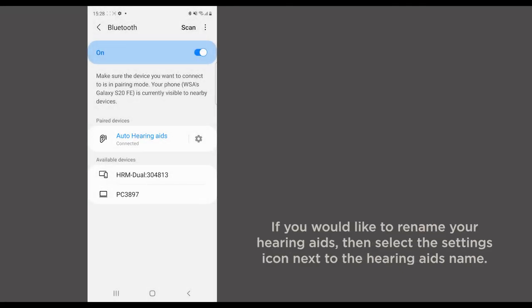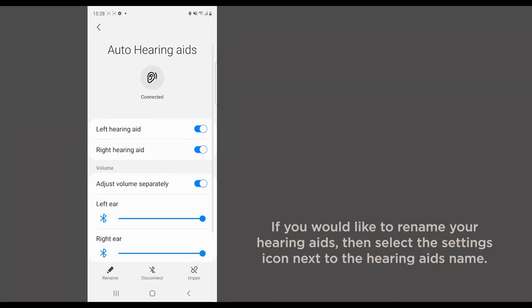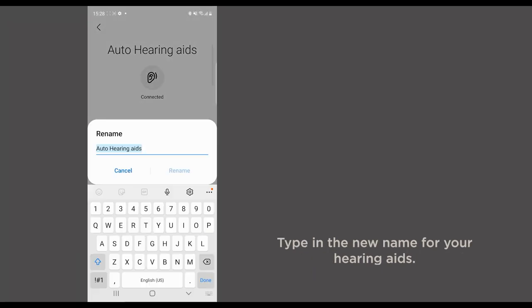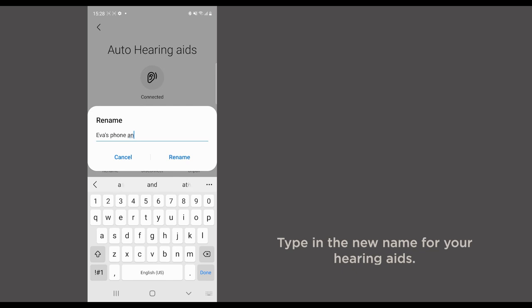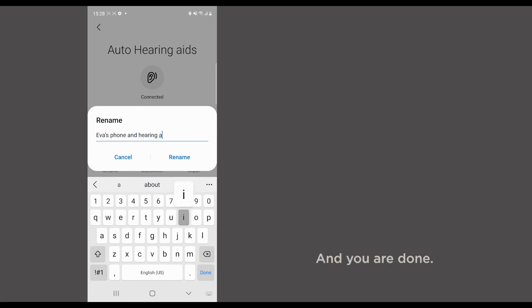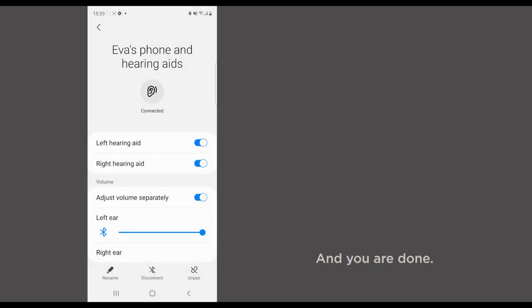If you would like to rename your hearing aids, then select the settings icon next to the hearing aids name. Type in the new name for your hearing aids. And you are done.